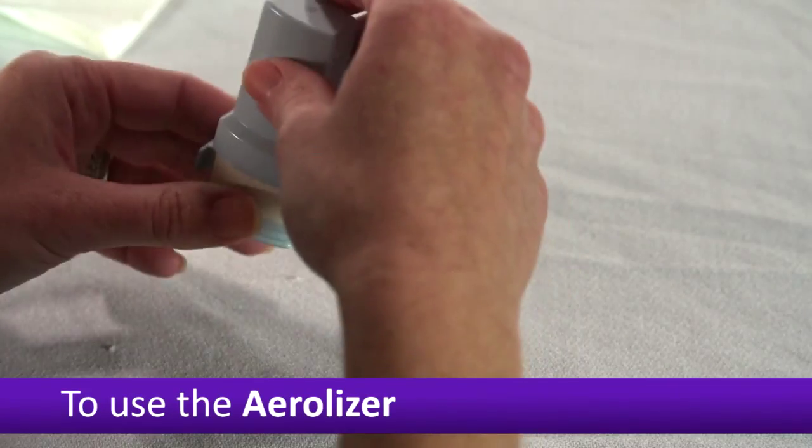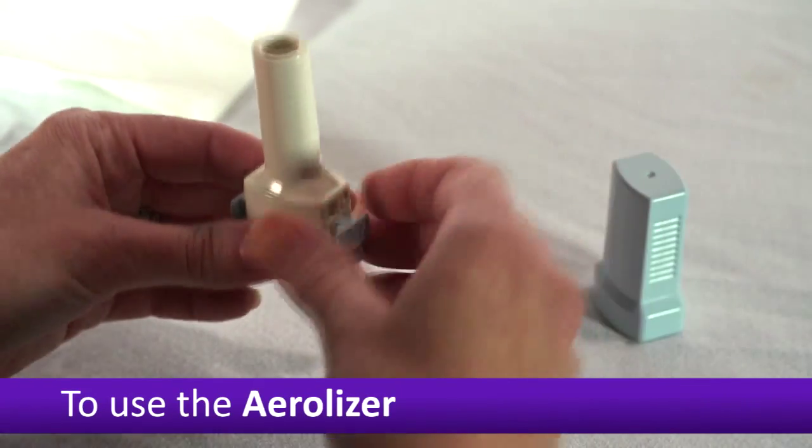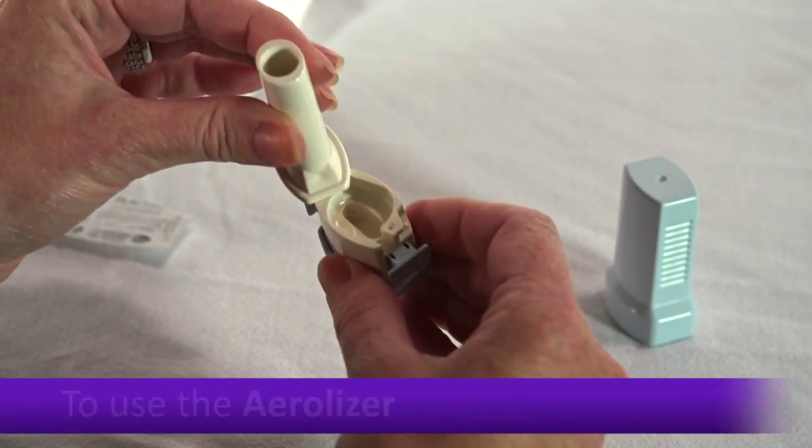To use the Airelyzer, first remove the mouthpiece cover. Twist the mouthpiece open.